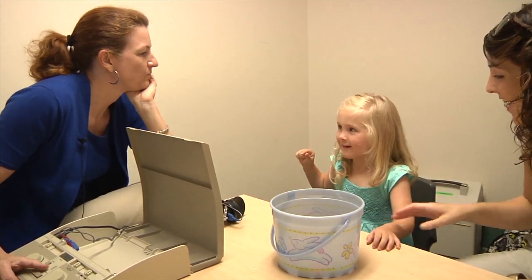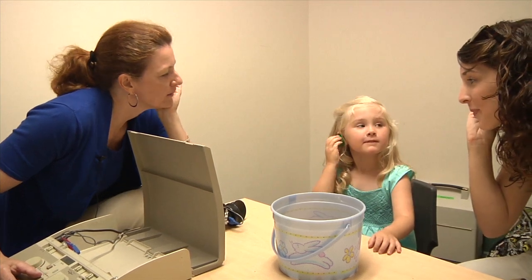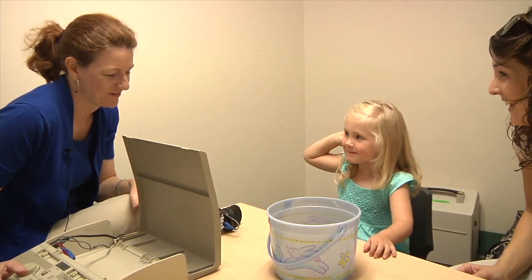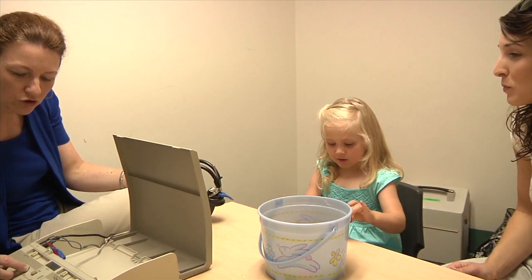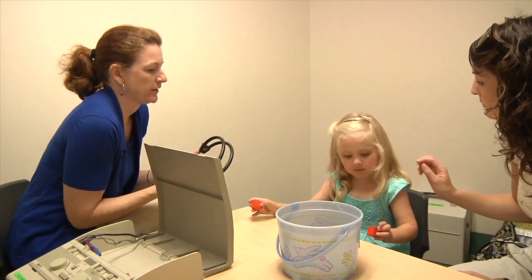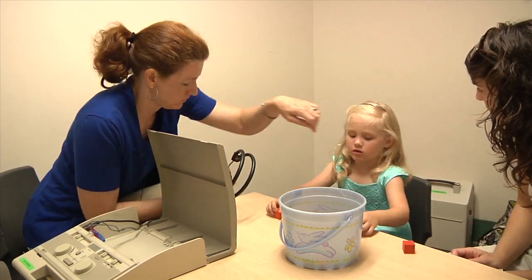Oh, Elena won. Good job. Can we try one more? Do we all have to be green again? Yeah? Okay, we ready? I don't know. What do you think? Do you think you beat your mom that time, getting it in there? Okay. All right. Now what we're going to do is we're going to put the earphones on your ears, and the beeps are going to be really quiet. Okay. All right. But this time, only you get to hear the beeps, because they're going to be right next to your ears. So you're going to have to let us know when the beeps are there.